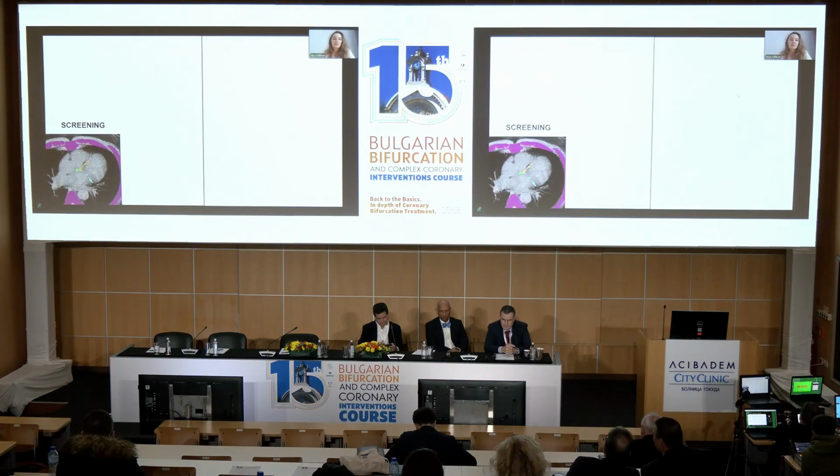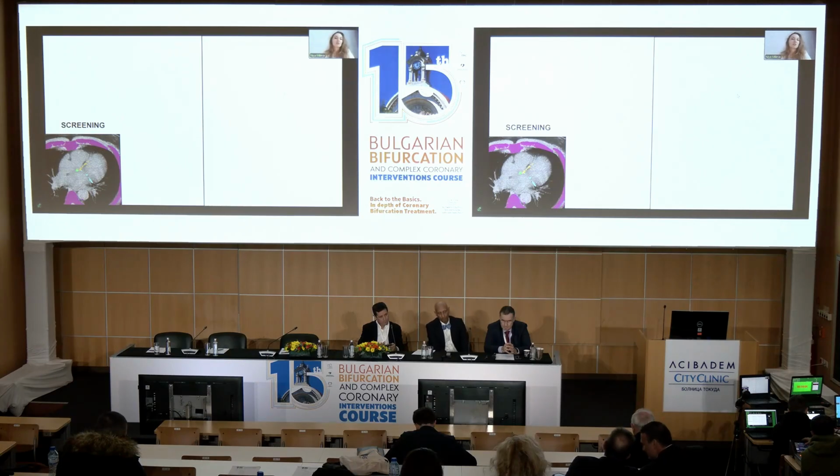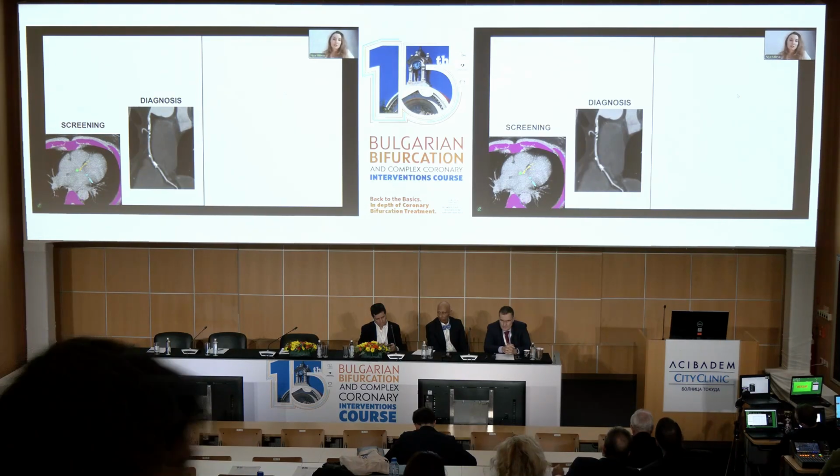Just 10 years ago, CT was only seen as a screening tool, used to evaluate patients with the lowest risk. Then, with the advancement of CT technology and artificial intelligence, we started using CT angiography more and more to diagnose our patients and see if they have obstructive or non-obstructive coronary artery disease.